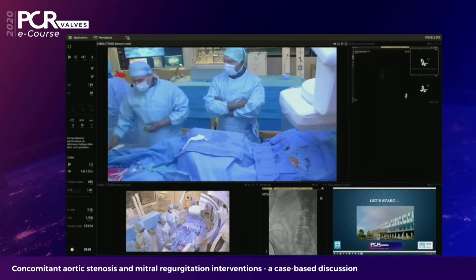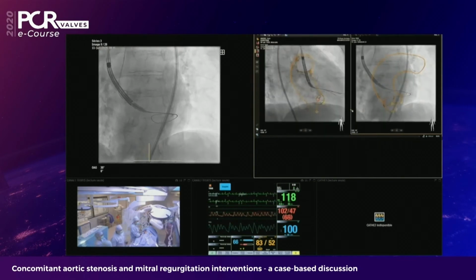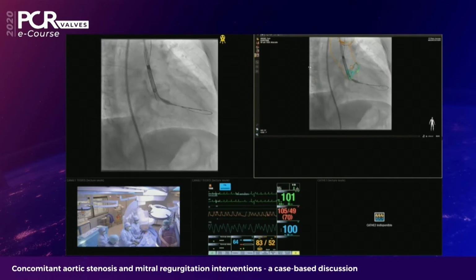So we can start. We use the interventional tool for fusioning the phantom of our CT with the X-ray. The machine suggests you 2 C-arm orientation. You don't have to use a lot of contrast, and by yourself at the table with your mouse you can adjust the 2 pictures, and it's very easy, very rapid to do, and then it will be very easy to go in cusp overlap view, just pushing a button. So we choose this view to deploy the valve.